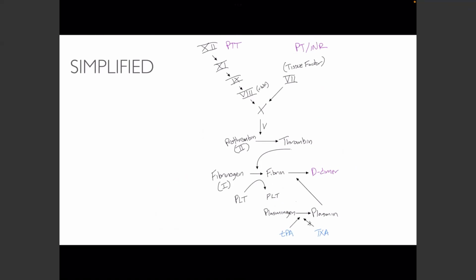But this is really all the clotting factors that you need to know to understand it. So you really just have to know the basic clotting factors, what process you're at, and then when you get to the bottom with the platelet amplification and aggregation, those are kind of the basic steps. So if you can have this and correlate it to the graph you're looking at, you'll be able to interpret pretty much everything you see.